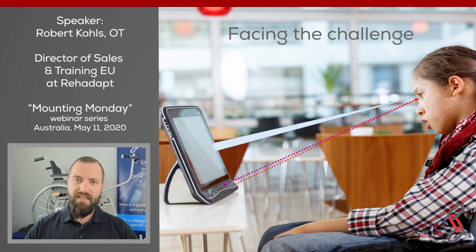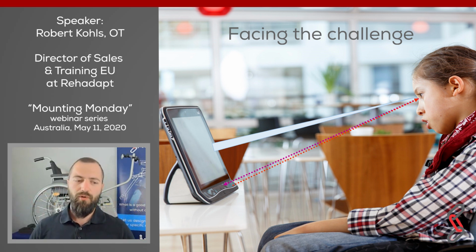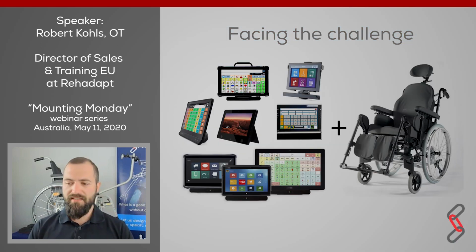So we need to find a good, stable and safe position for the customer at his wheelchair, where he can have a good track status, where he can have good eye-controlled access to his AAC device. I think this is something that you all know. Every AAC device is a little bit different. There is a wide range of different devices from Tobii, from iRespond, from Smartbox, from Human Electronic, from PRC. Every eye tracking system has a different way of working and a different range of movement that the customer can have when he needs to access the device.